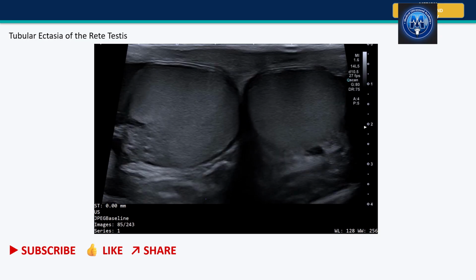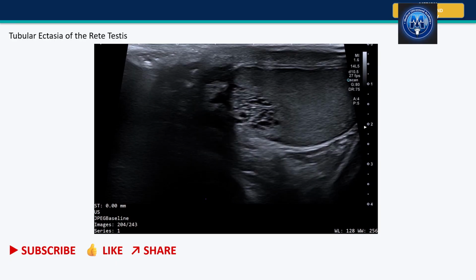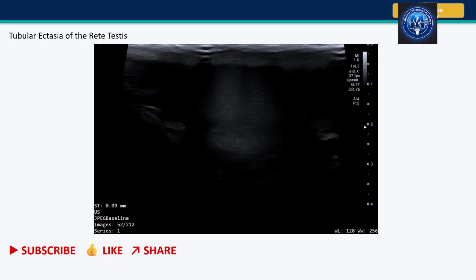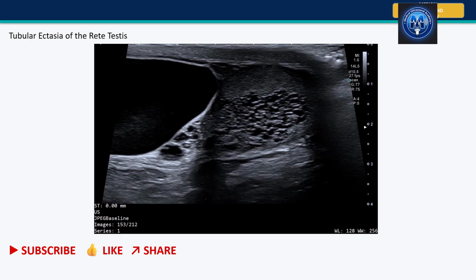So the scrotum needs a very good special mention. The next case that I'm going to present is also the testicle. You are going to see that we saved the testicle yesterday.